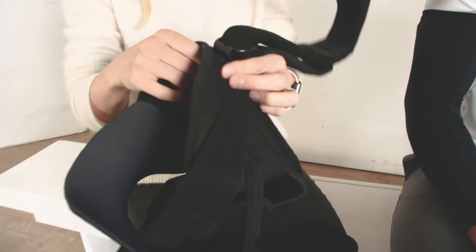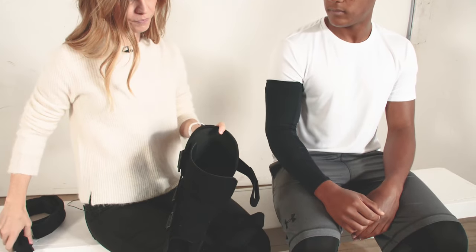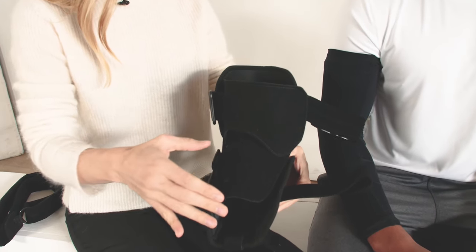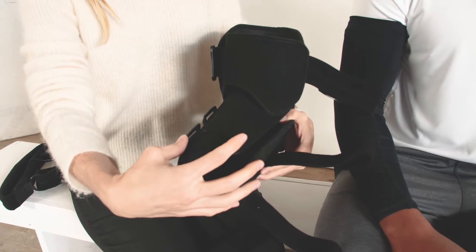Next I'm going to remove the sling piece so that it's out of the way for the rest of the application process. Next I would need to adjust these Sarmiento cuffs so that they're in the right position both proximally and distally, and create the best circumferential fit.